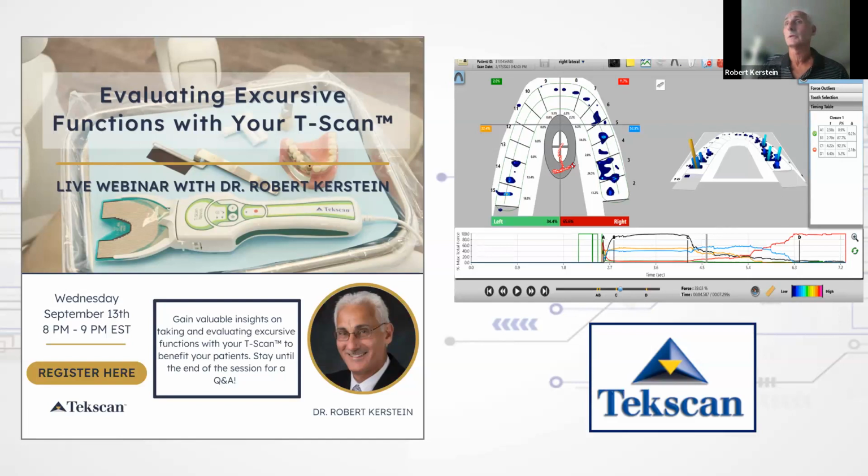Excursions are the limit of chewing. In other words, if you chew to the left or the right, you're making excursive movements. You don't chew as far as we might measure an excursion in a T-scan recording, but what's found in the excursive T-scan recordings has a huge impact on chewing and function.